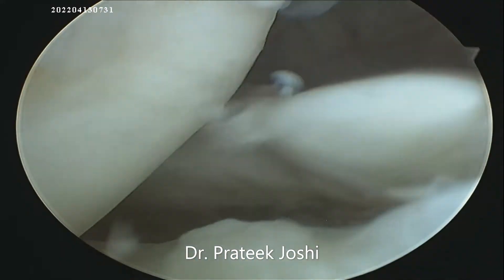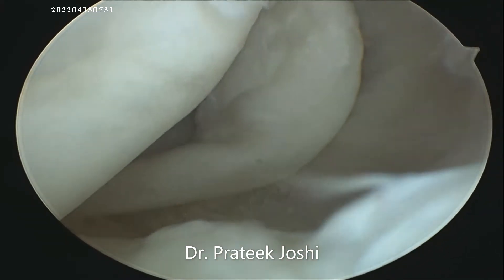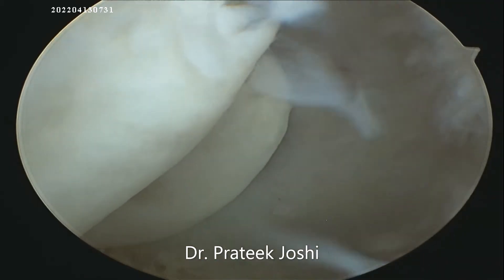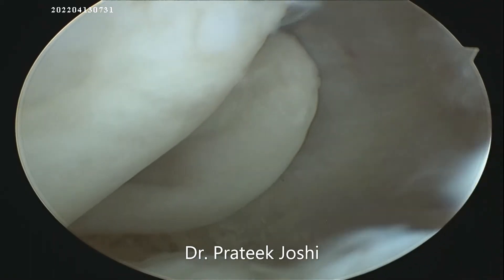This is a case of a chronic neglected bucket handle tear of the medial meniscus in the right knee joint. Eventually, the torn portion of the meniscus got separated from the meniscus and now it is roaming in the knee joint as a loose body.